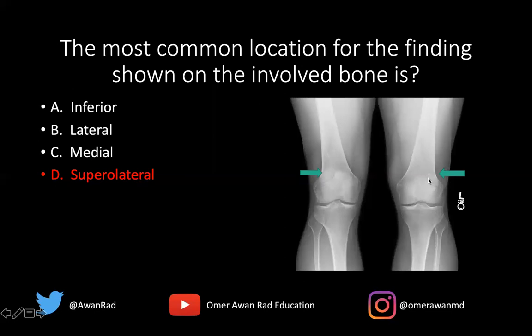This is actually a bilateral finding in this case. It's not always bilateral, but it can be bilateral. This is just a normal variant that we see. Sometimes it's confused for a fracture. This is a nice example of what a bipartite patella is. The core exam often tests normal variants, so this is a very important one for all of us to know and understand.